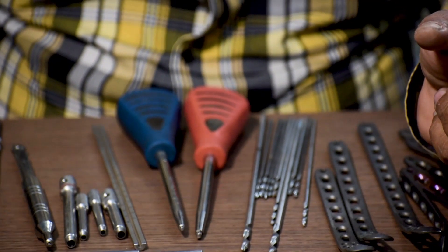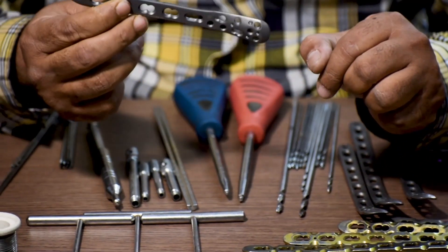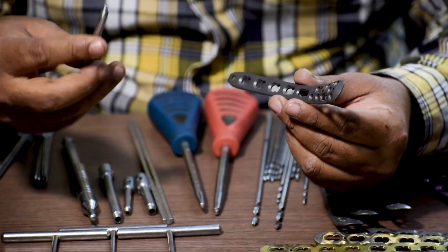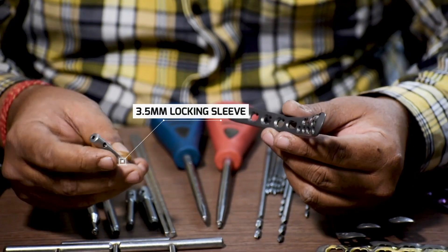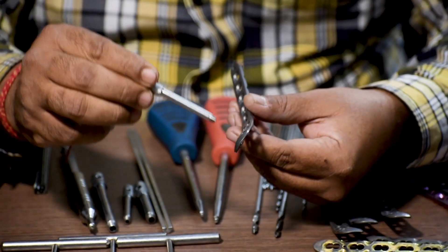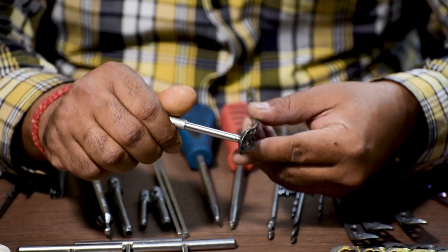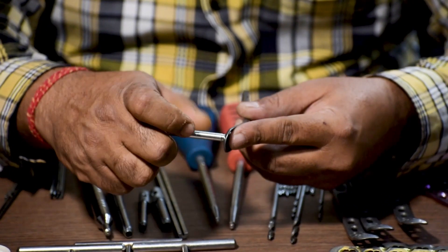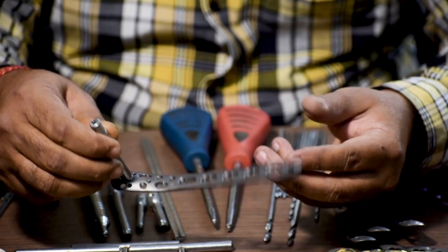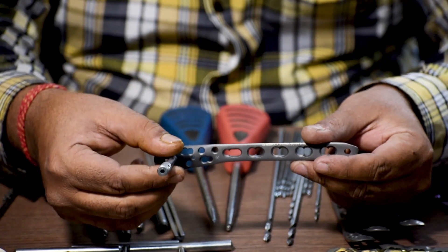After this, take the plate of the required size. As said, we are taking the right side plate. Before inserting this plate, we will attach a 3.5 mm locking sleeve in the center hole of this part of the plate. Once fixed, it is placed in the fracture site.